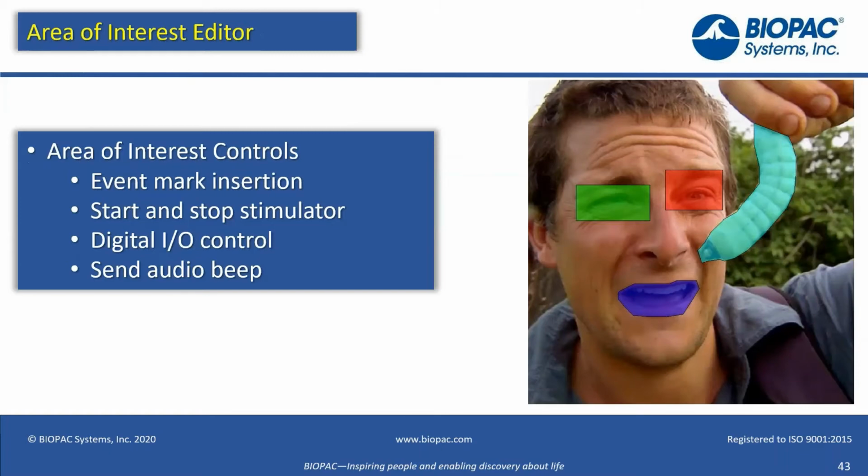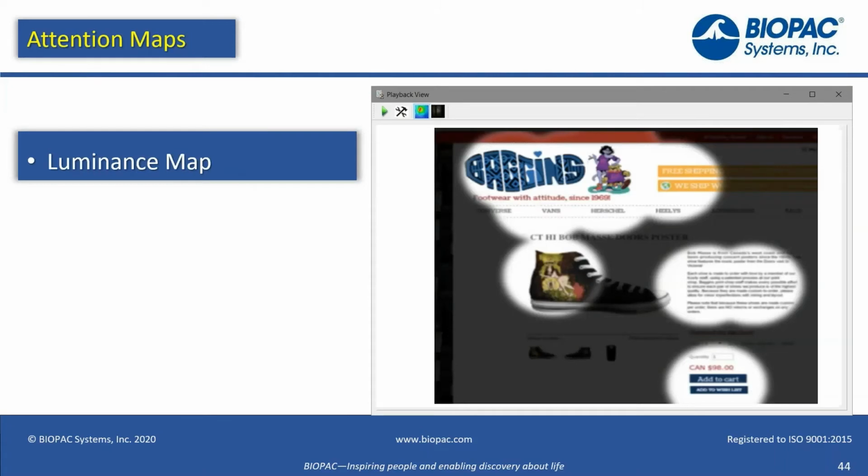And then within the software, we allow you to create areas of interest. So you can mask different areas that you particularly care about, and as the participant hits those areas, we track different metrics, and different things that you'll be able to do, such as starting and stopping a stimulator. We can send out digital I/O information to trigger other devices or provide some kind of auditory feedback. So the areas of interest provide a little bit more information.